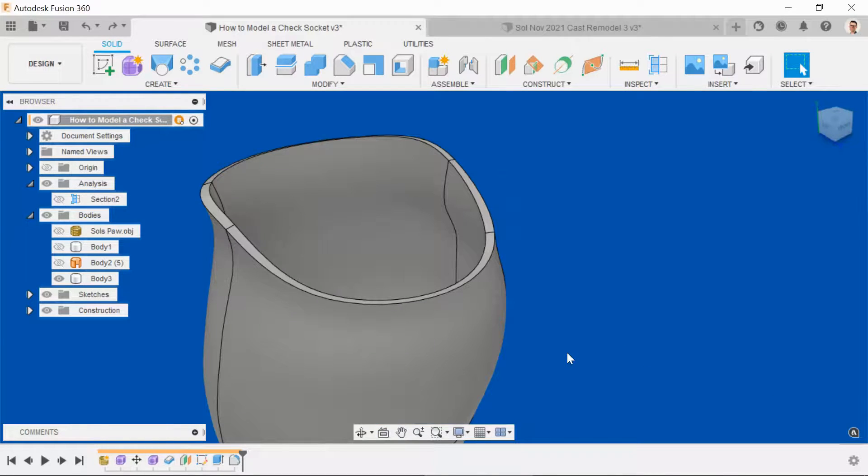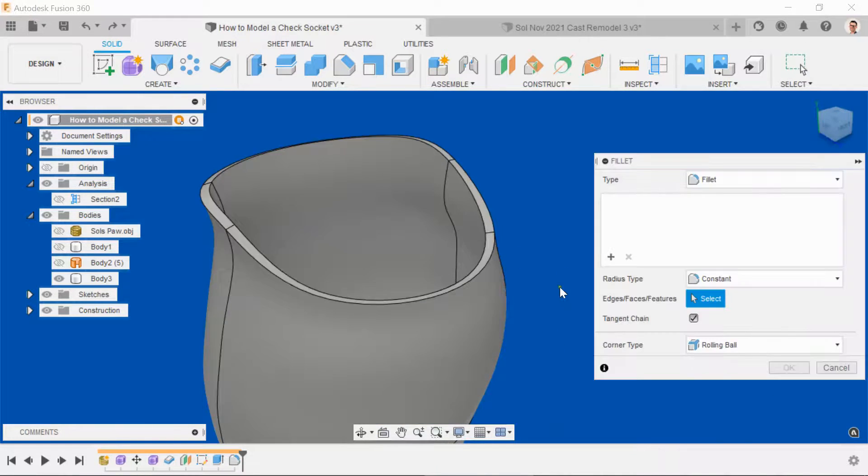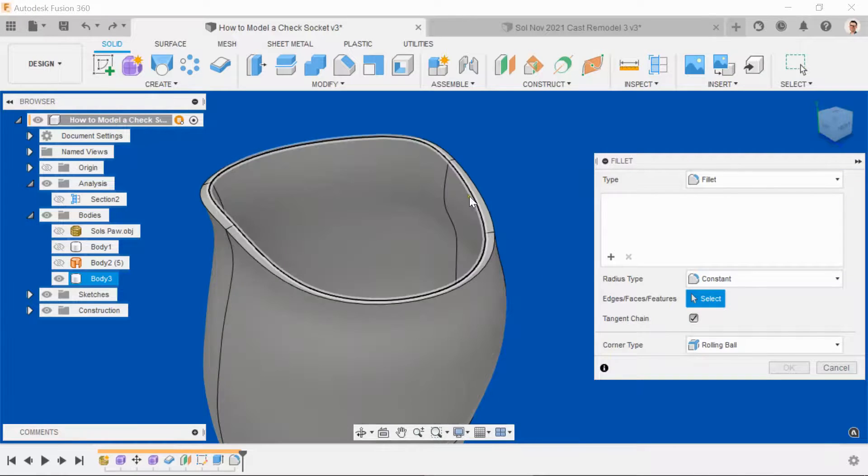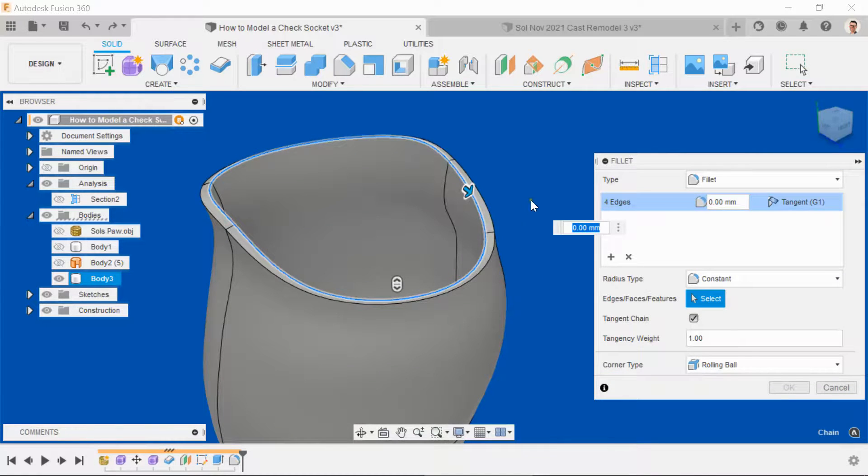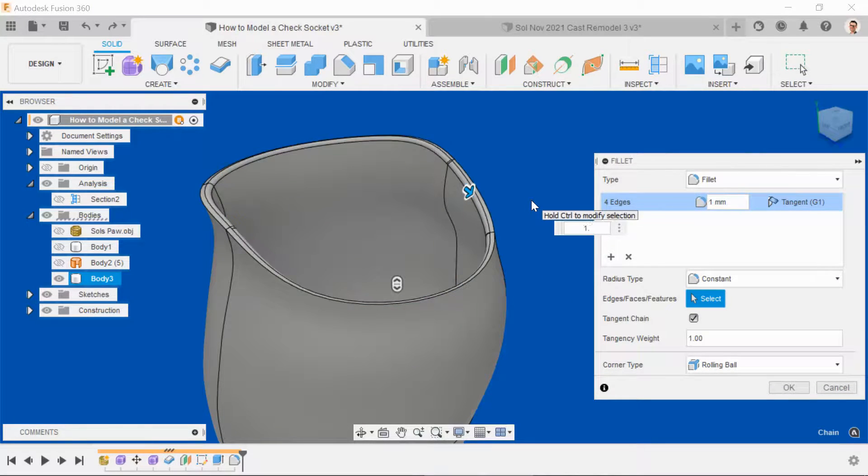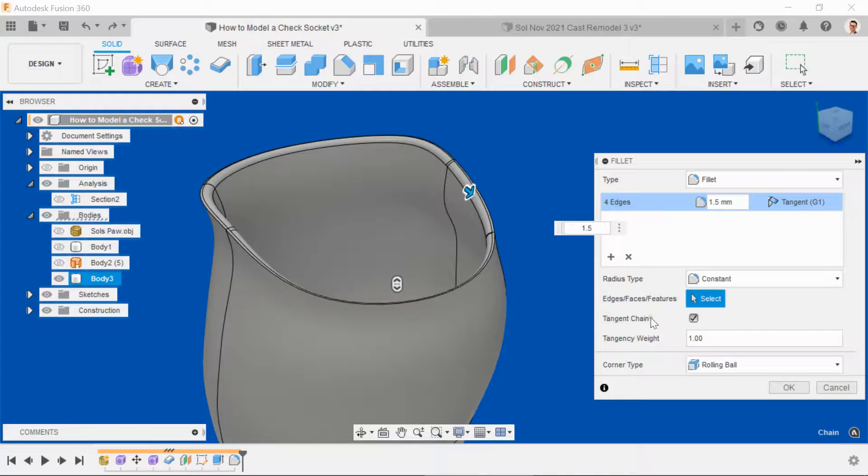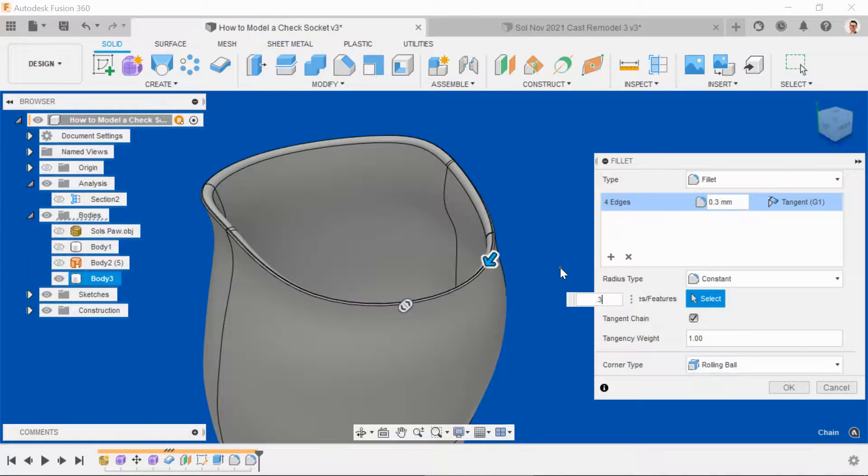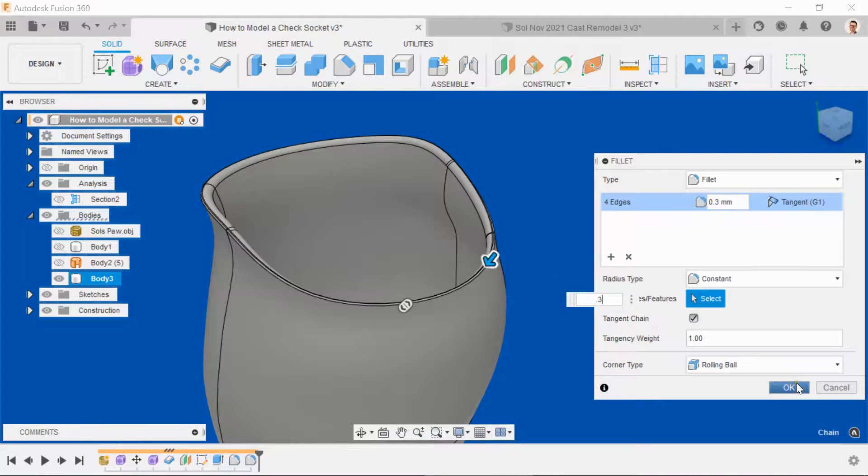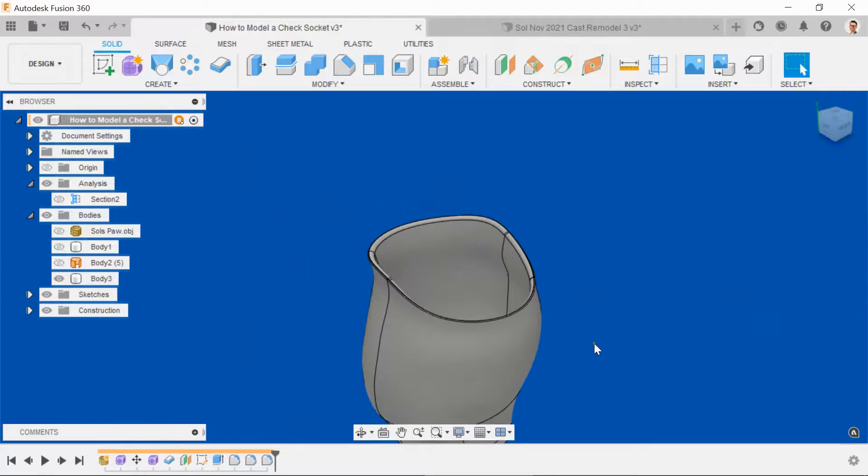Don't forget to put a fillet on the top for comfort of fit. Select the inside edge. This is a 2mm thick wall, so I'm going to do a 1.5mm fillet, and then separately a 0.3mm finish on the outside. Now we're good to go.